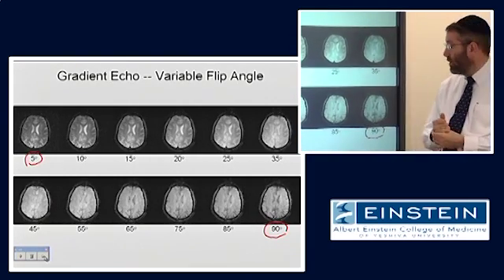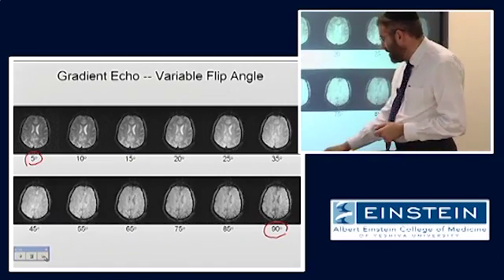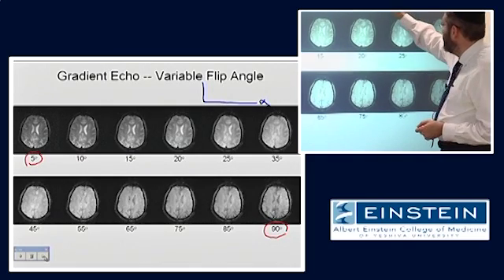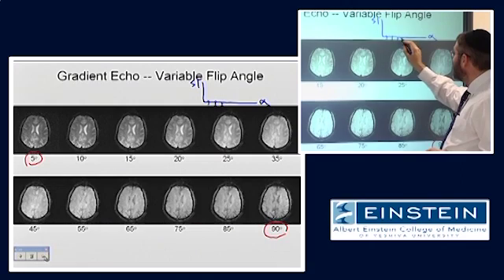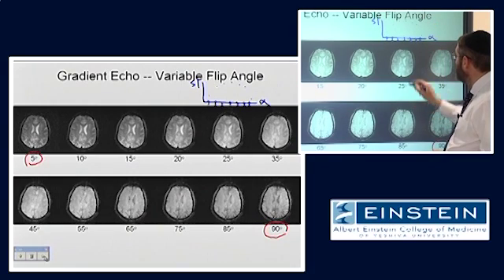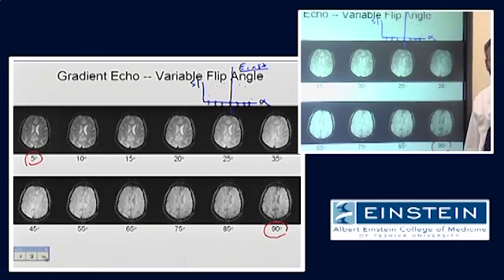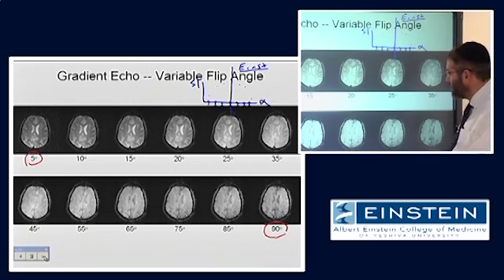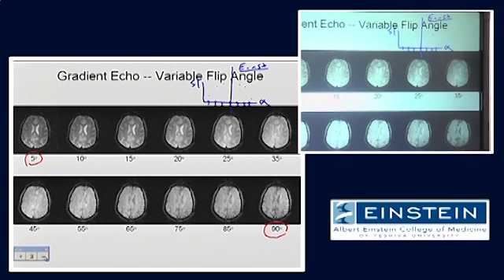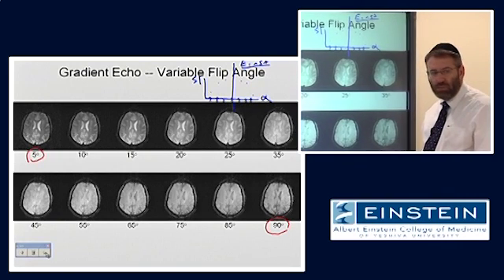55. Okay, why do you say 55? The signal to noise. Right, so the Ernst angle, we're essentially replicating that graph which I drew. Right? This is the flip angle. This is signal intensity. So we have a whole bunch of different flip angles, and we can plot the signal intensity where it peaks is the Ernst angle. So you would typically do this by measuring, but we could sort of approximate that it seems to be somewhere in the 45, 55 range that the image seems to have the largest amount of signal. Okay? Any questions about this?